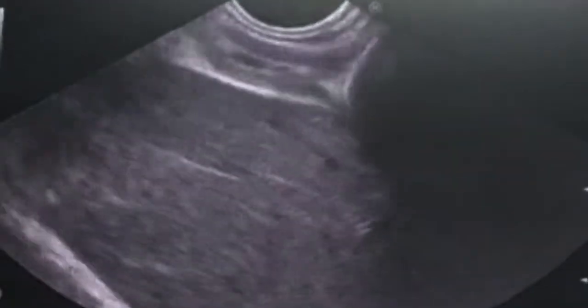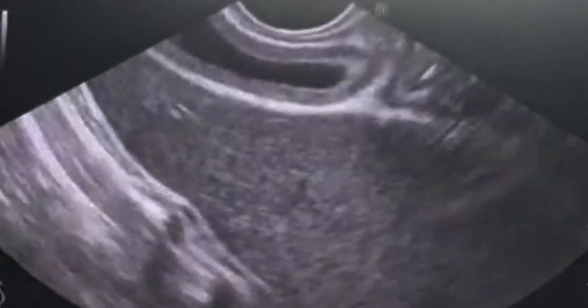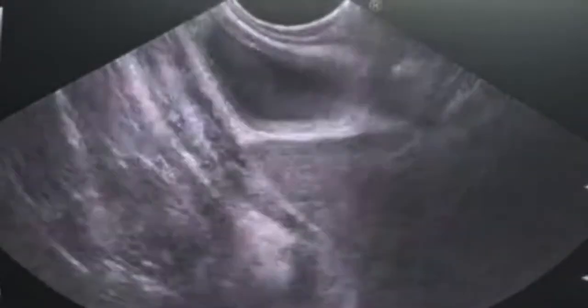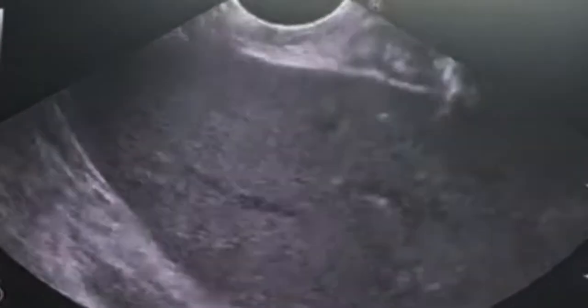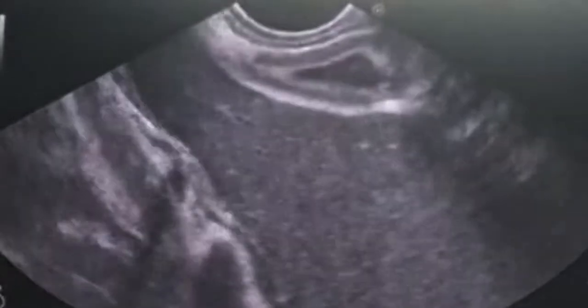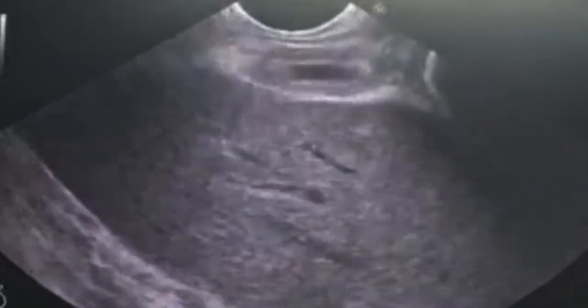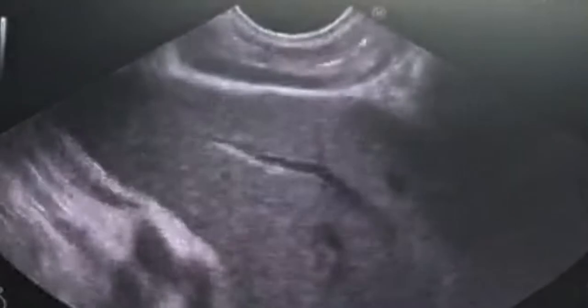This is the rest of the gallbladder — multiple stones. This is another large stone. Pushing up maximum, more than 90 degrees, and slight anticockwise rotation. Yes, that's good.